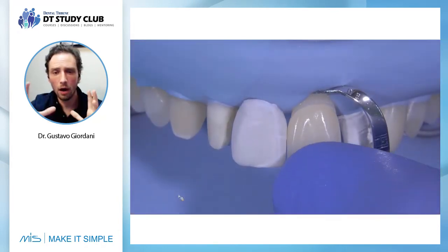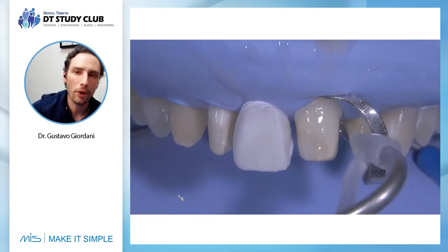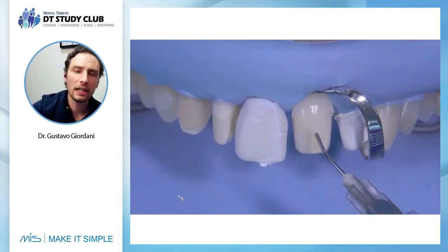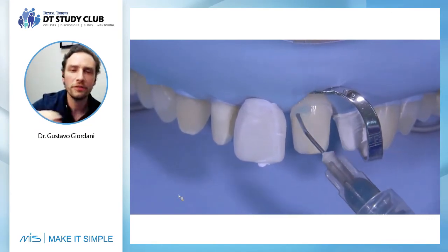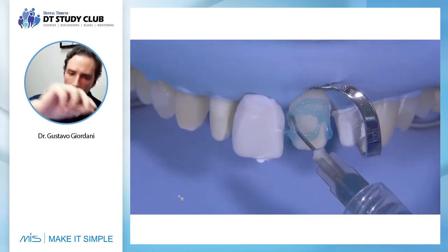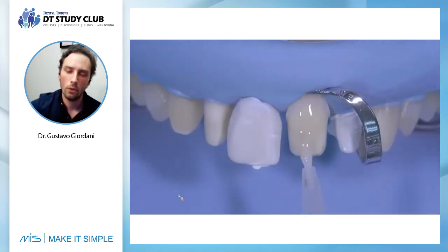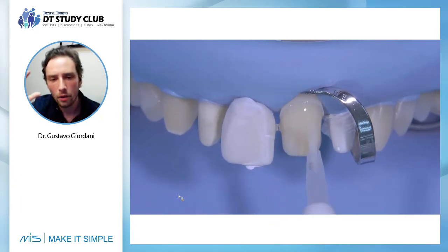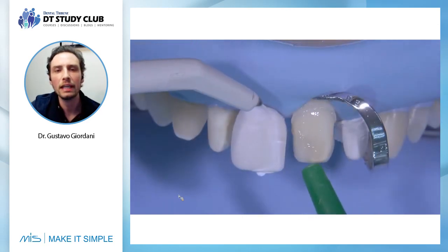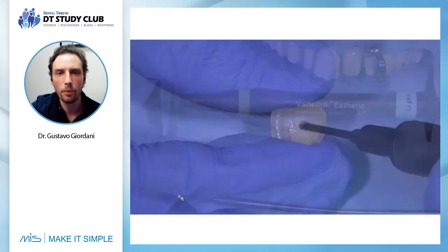So now, using the rubber dam, using the isolation, we clean the prep by using Aquacare. After cleaning the prep, we use 15 seconds of etching, phosphoric acid. We etch for 15 seconds. We clean very well. After that, we use the bond. And by using the rubber dam, it's very easy to clean very well. It's very easy to be safe in your bonding process.